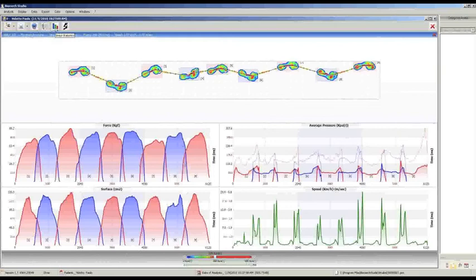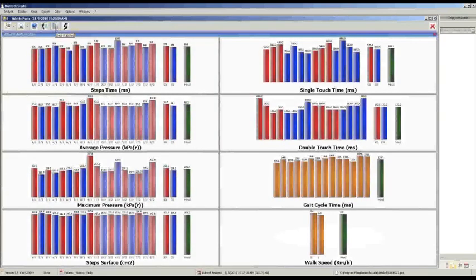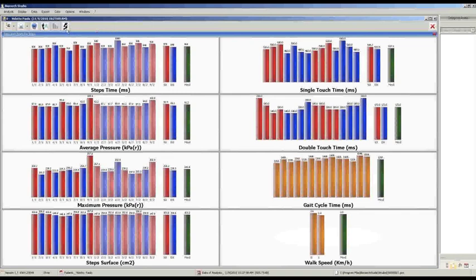Then we have the histogram evaluation as seen in the single platform analysis — the step time, average pressure, maximum pressure, and step surface. On the other side: the single touch time, the double touch time, the gait cycle time, and the walk speed. In the last part we have the left and right values and the mean value, with the green bar representing the average for the entire walking. Clicking on the last part — view step sequence and dynamic analysis — shows the same analysis available with the single platform.